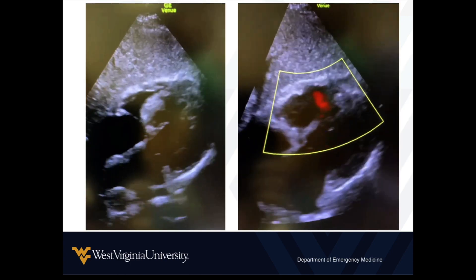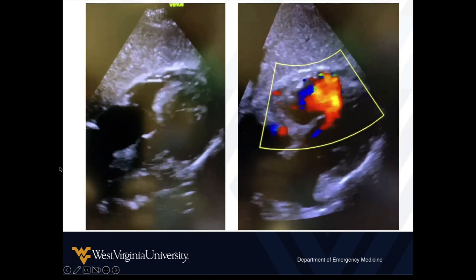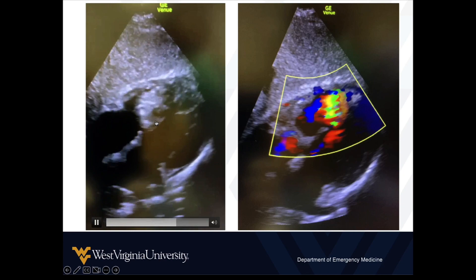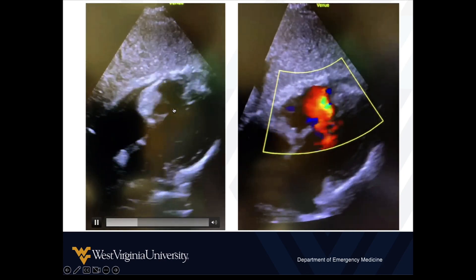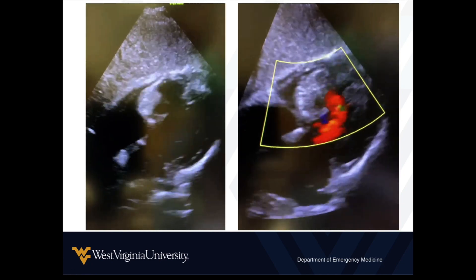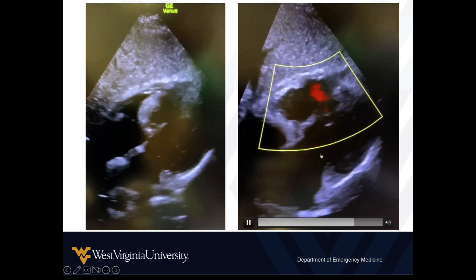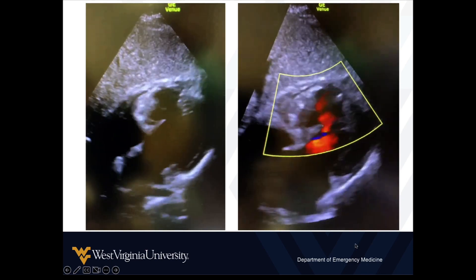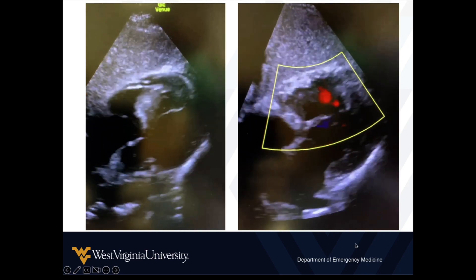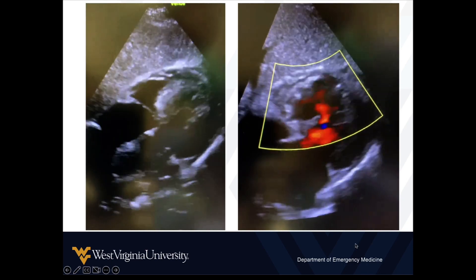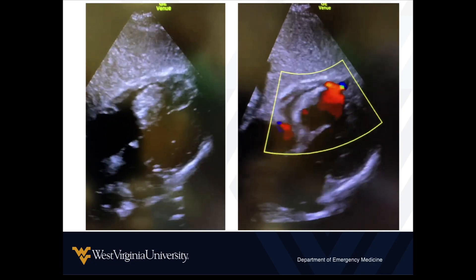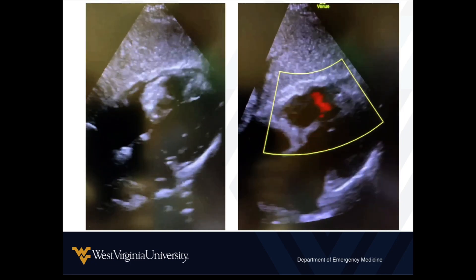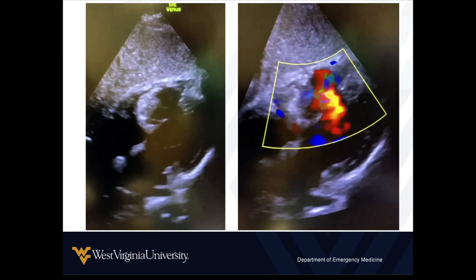One last example — this one was pretty obvious. This is a case where we can see the VSD, and here we can see color with flow moving from the left ventricle to the right ventricle. Even some fingers pointing it out, which just shows you the diagnostic acumen of some of our emergency physicians here at West Virginia University.